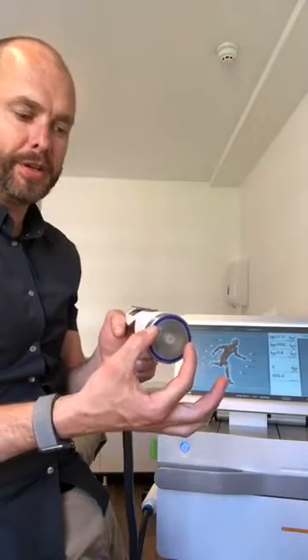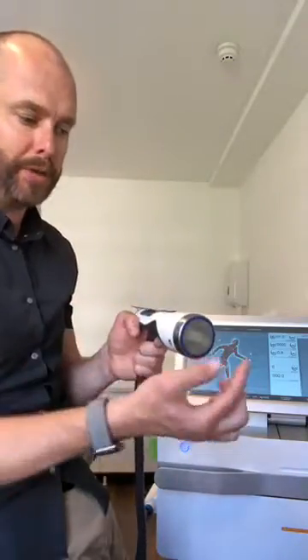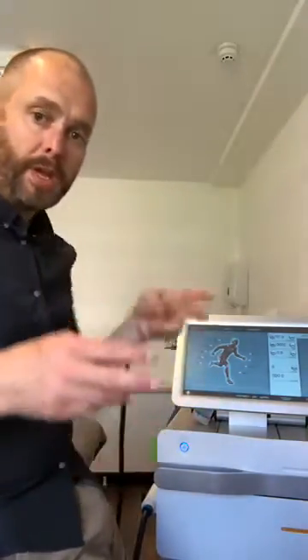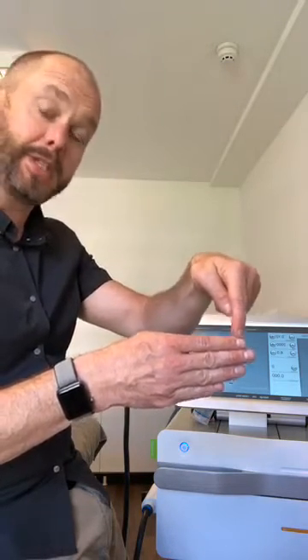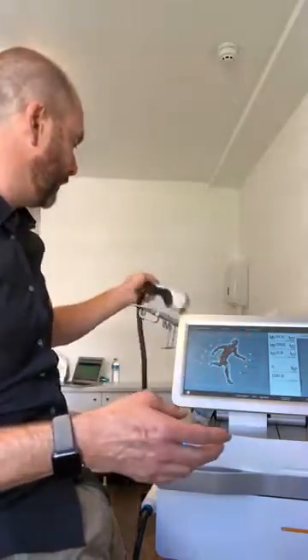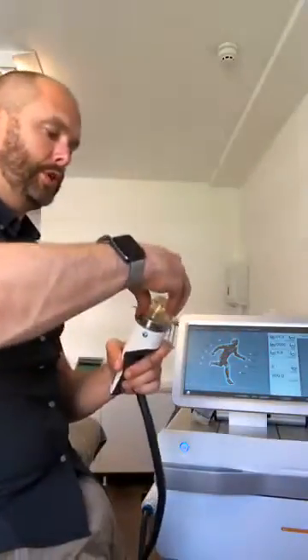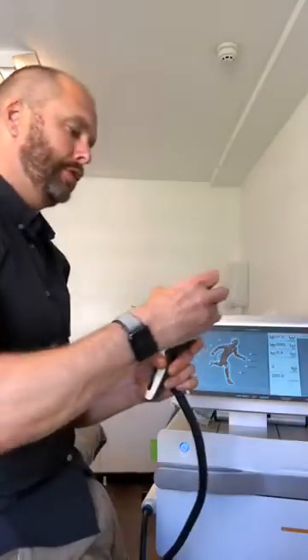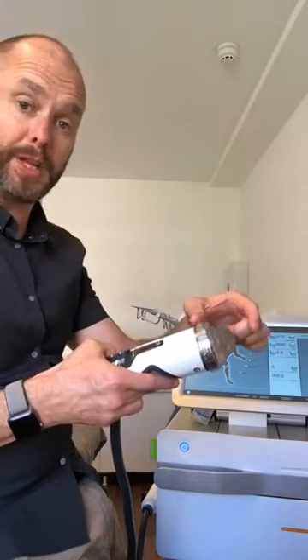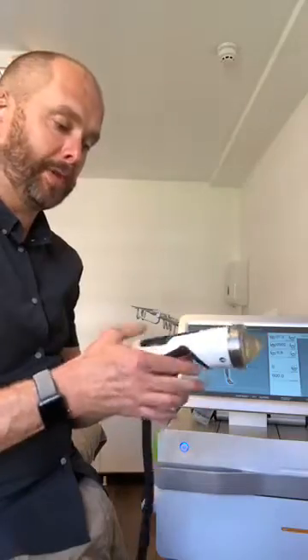Effectively what happens is the shockwave that comes out goes out at different angles via the parabola and you end up with the focus point about five centimetres down. So it's quite difficult to make sure that you're right on the spot that's hurting. For example, I've just worked on a shin splint, so we used the standoff so that we are doing a much more shallow treatment — only going probably about 20mm in.